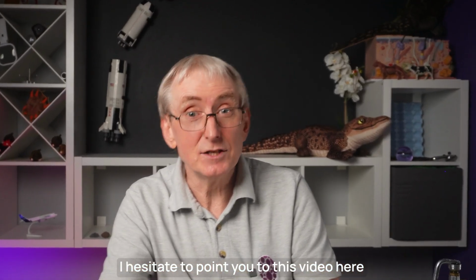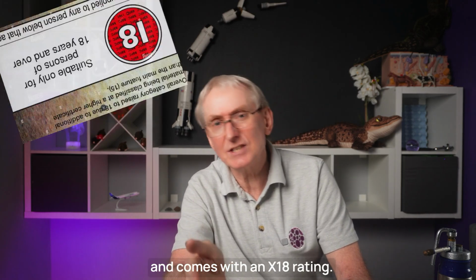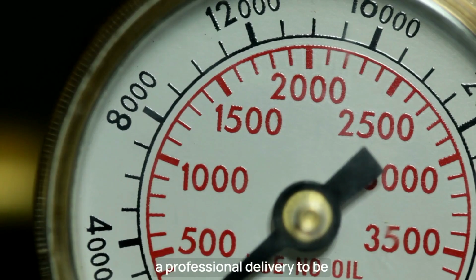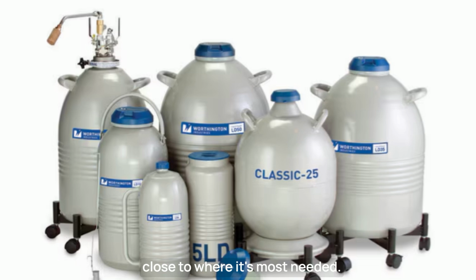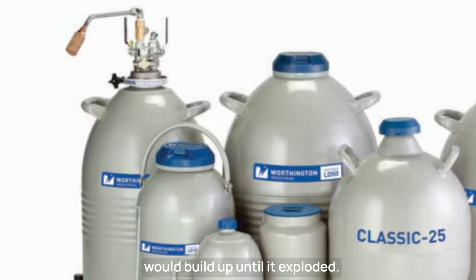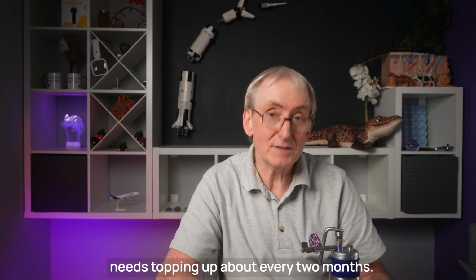I hesitate to point you to this video here, just to say this video is an experiment and comes with an X18 rating. What's the point of all this if you don't have access to liquid nitrogen? It's an industrial liquid and needs a professional delivery to be stored in what are called dewars close to where it's most needed. These dewars come in a variety of sizes. They have a pressure release valve because if they didn't, the pressure would build up until it exploded. The contents gradually evaporate and ours needs topping up about every 2 months.